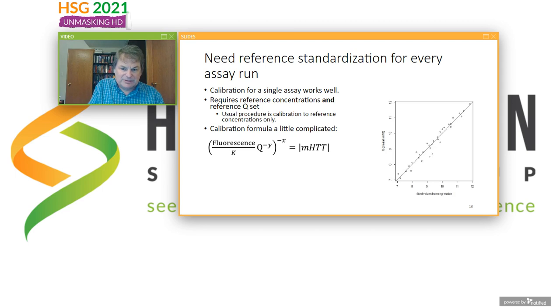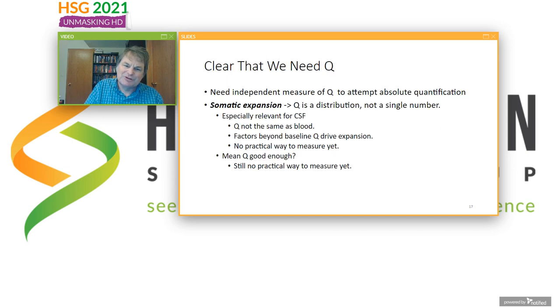It gets kind of complicated and a big task because of the multiplicity of probably needing to look at maybe 4 to 6 Q lengths rather than just calibration of a single concentration, which is usually what's done to calibrate assays where we don't have to worry about different size molecules.